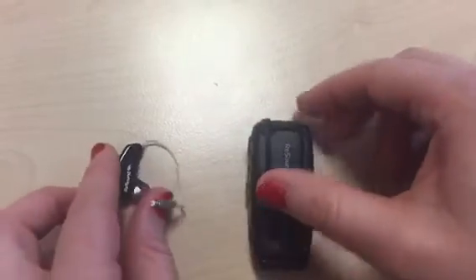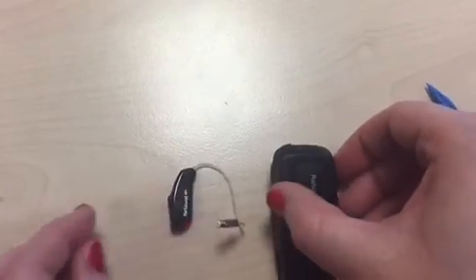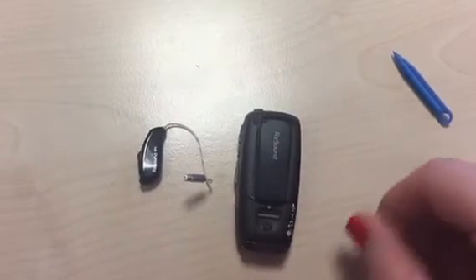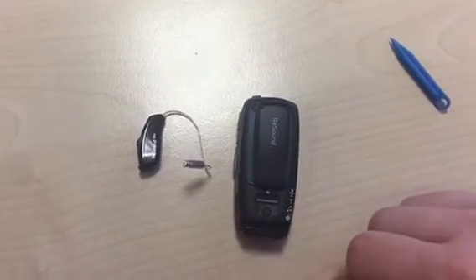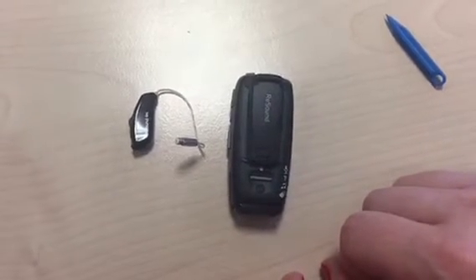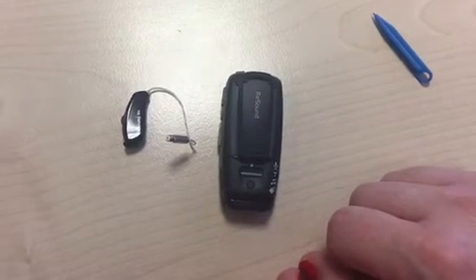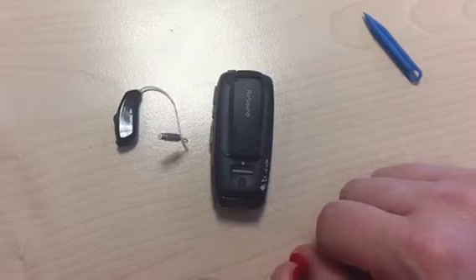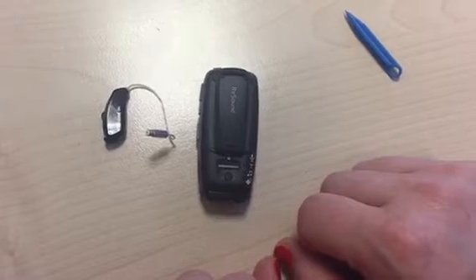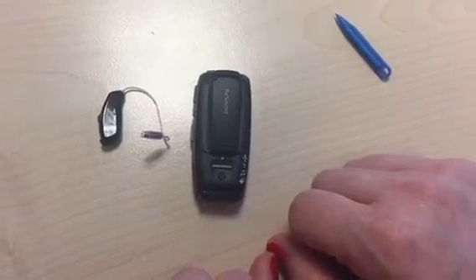Close up the battery door on the hearing aid and wait 12 seconds. If you are able to hear the very soft tones from the hearing aid, you will notice it does 10 chimes and then a little melody to show you it is now connected to the multi mic. After the 12 seconds, the two are paired and connected together.